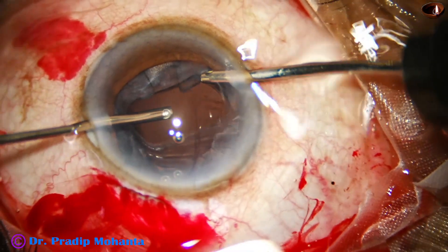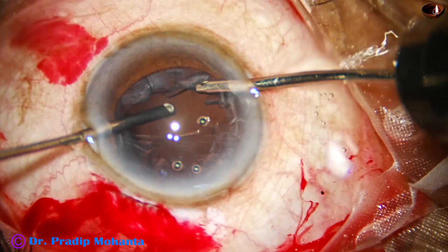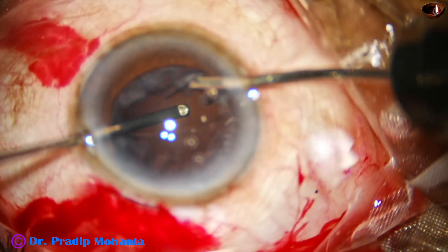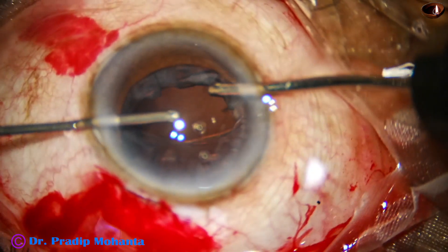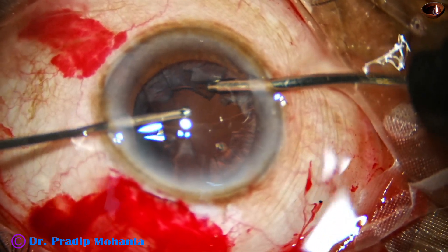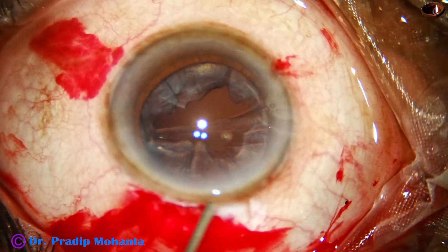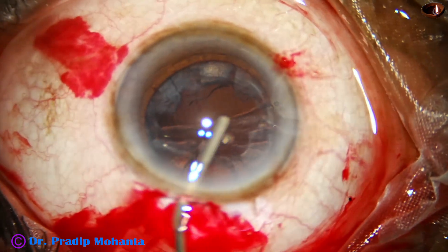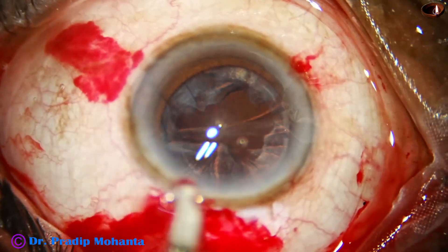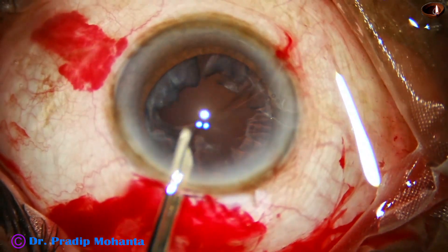I start vitrectomy. The settings are: cut rate 3000 per minute, vacuum 200, and flow rate 30. Cutting is in progress. When I think that enough vitrectomy has been done and there are no more vitreous strands in the anterior chamber, I come out. The next plan is to remove the cortex. I inject some visco and dry aspirate the cortex — with very mild irrigation where flow is decreased. Cortex from six o'clock and seven o'clock is removed.